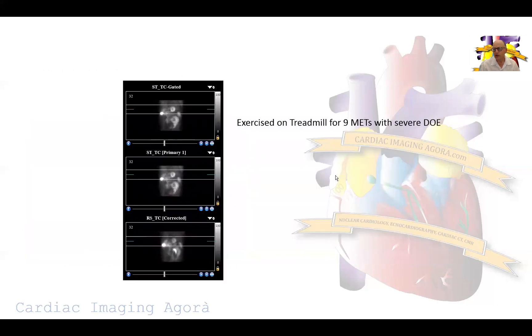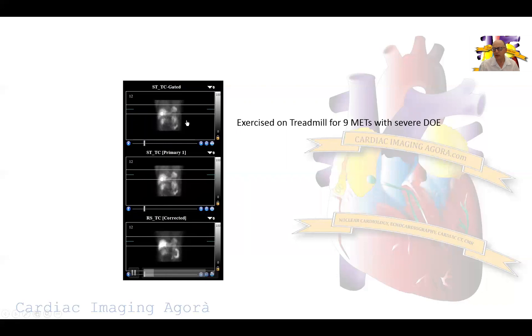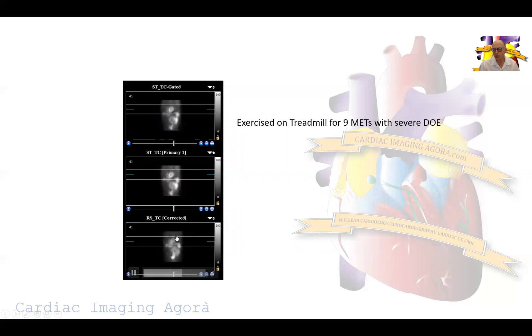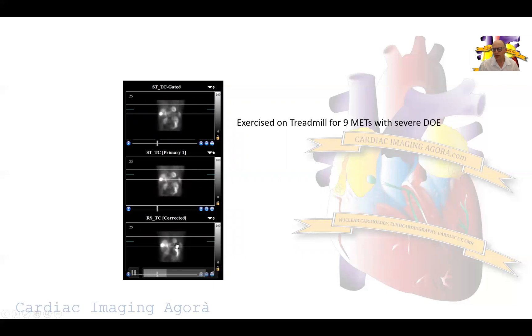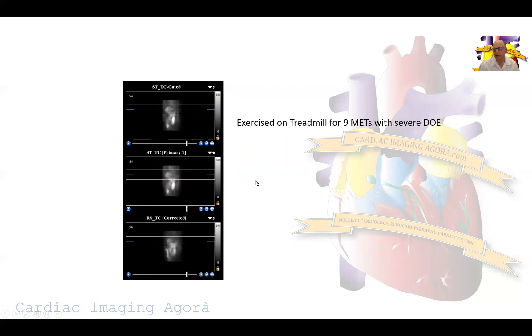This is the exercise part of the stress test. We have rest on the bottom, stress in the middle, and these are the gated images. These are the raw images which we review to make sure we control for motion, patient motion, extra-cardiac activity, chest activity, and basically QA for the stress test.